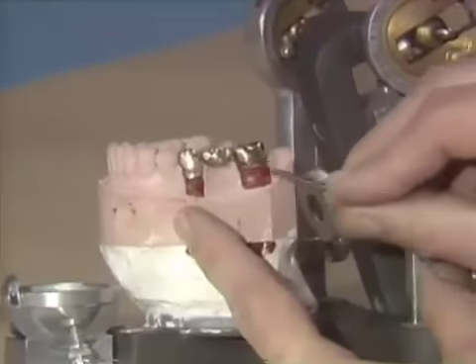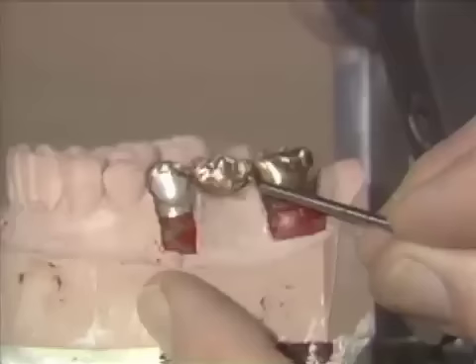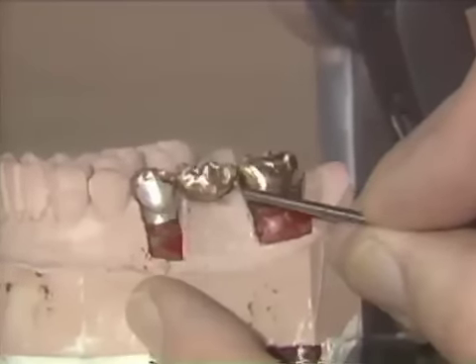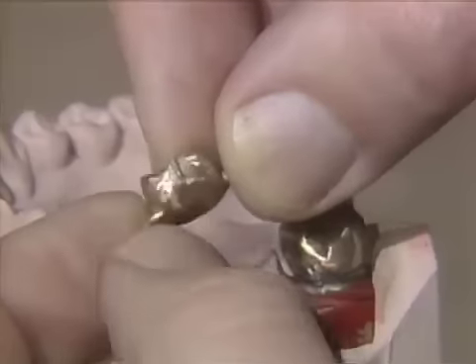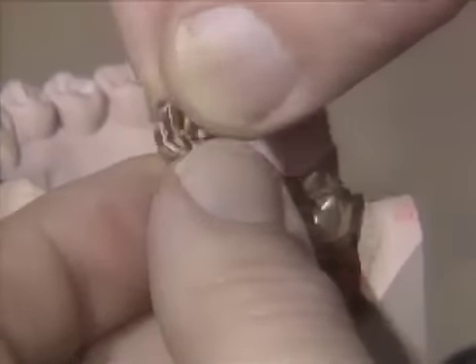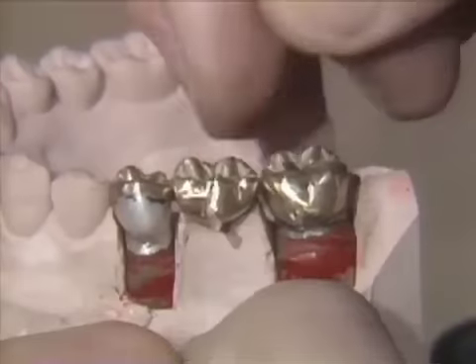Just to remind you that the most important areas to have adequate finish and adequate margins on the retainers are the interproximal areas, because once this is soldered together, these areas are going to be very, very hard to reach. Note that during our finishing, we have avoided the lug area on the pontic. We don't want to abrade these, because if we polish these down a lot, obviously the pontic will not fit well, and we are relying on that precise fit to relate our pontic.